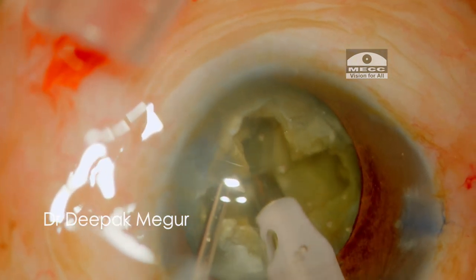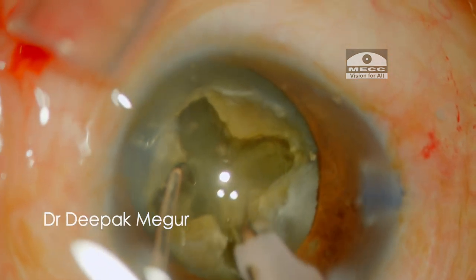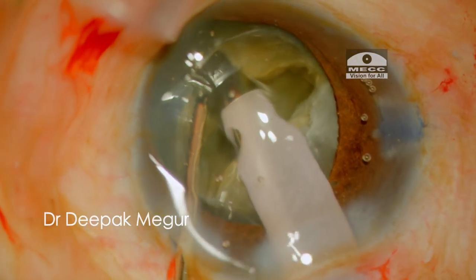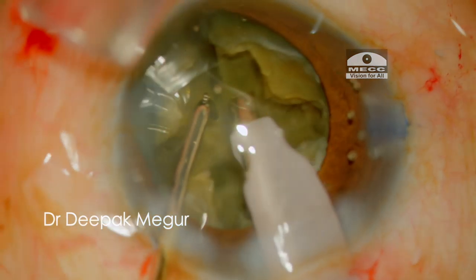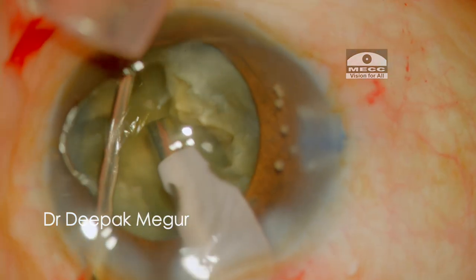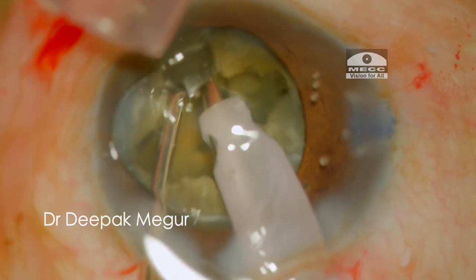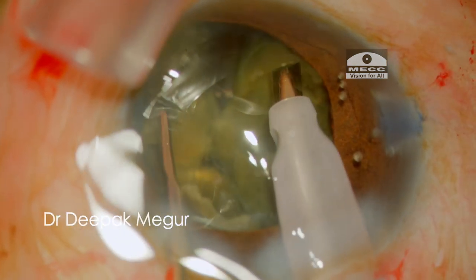I create deep trenches which are perpendicular to each other, and the depth should be almost 90 percent. Once the four deep trenches are created, now is the time to separate these quadrants. The lateral separation is being performed using the phaco probe and my second instrument. During lateral separation, it's important to place these instruments as deep into the trench as possible, pressed against the walls, and then moved away to separate the two fragments. As we can clearly see, the leathery fibres are indeed difficult to separate and it takes some effort to do so.